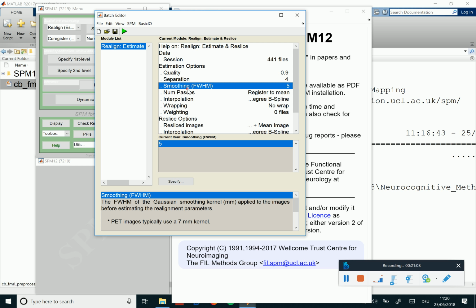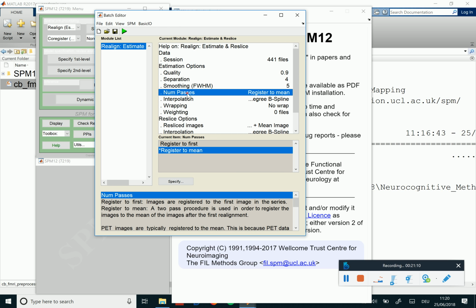It's like with everything in SPM, in the end the definition of what's going on is actually in the code only, and you will not find a paper that describes all of these parameters nicely, so you can understand what they mean in computational terms. So one could do what I'm doing currently in the summer term for the SPM p-values also for the realignment, in the same kind of manner.